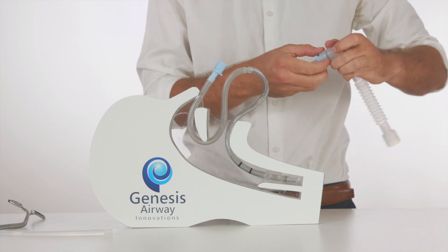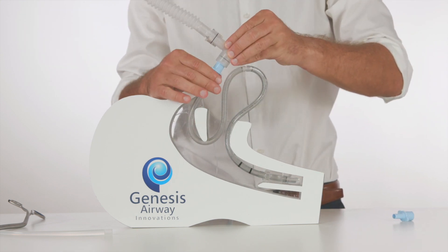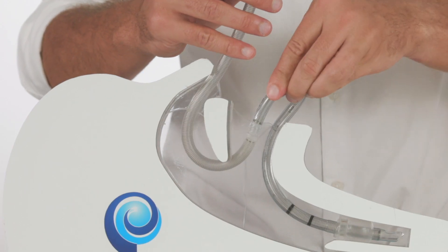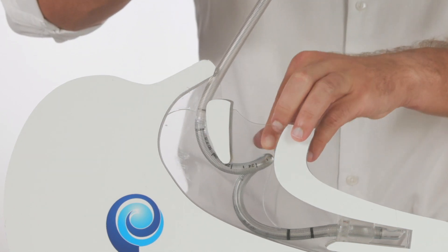The patient can then again be ventilated, and the airway tubing is gently fed back into the mouth and retracted through the nose until the connection is present outside the nose.